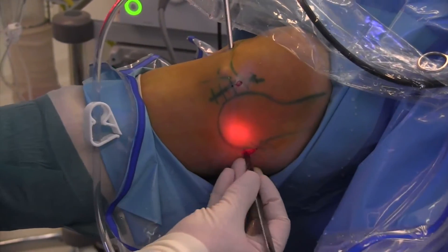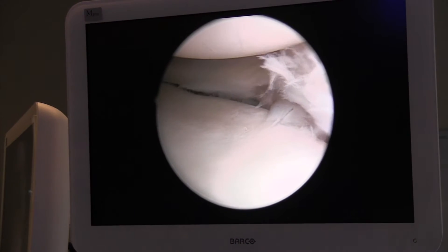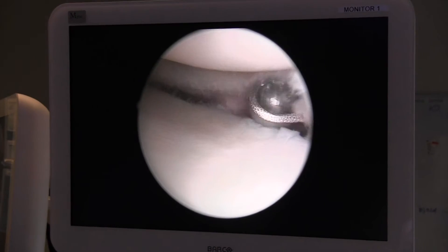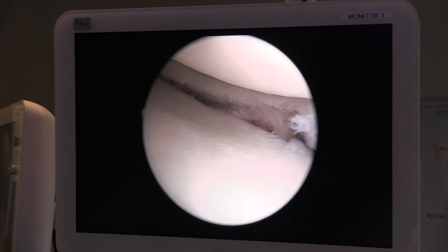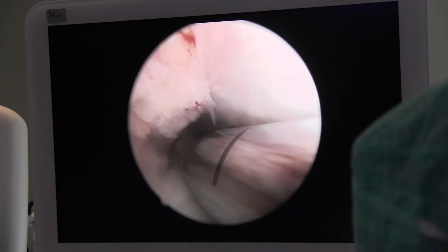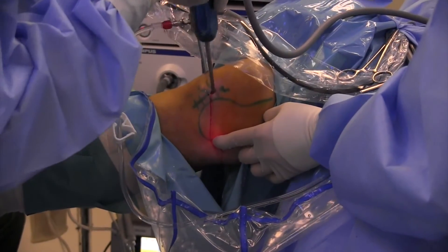I make a horizontal incision with the knife, so as not to get problems with the rim or cut the rim. I prepare the tibial plateau. Here is the shaver. This is the anatomical position where I can put the donor meniscus in.